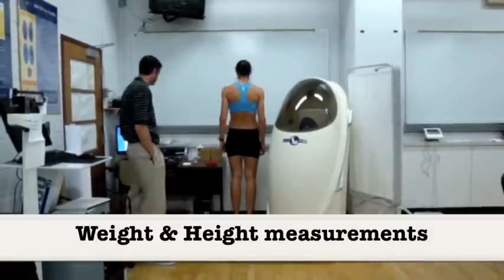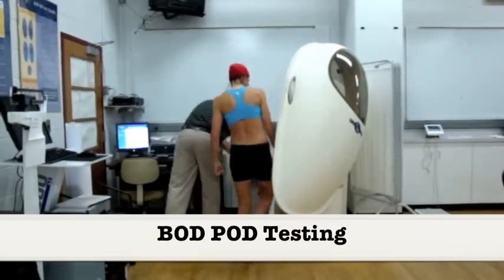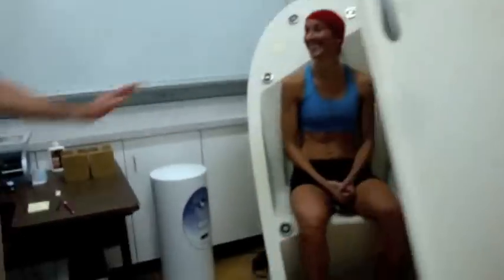Height and weight must be measured before testing. All subjects must wear a swimsuit and swim cap during the BOD Pod test. This minimizes errors.